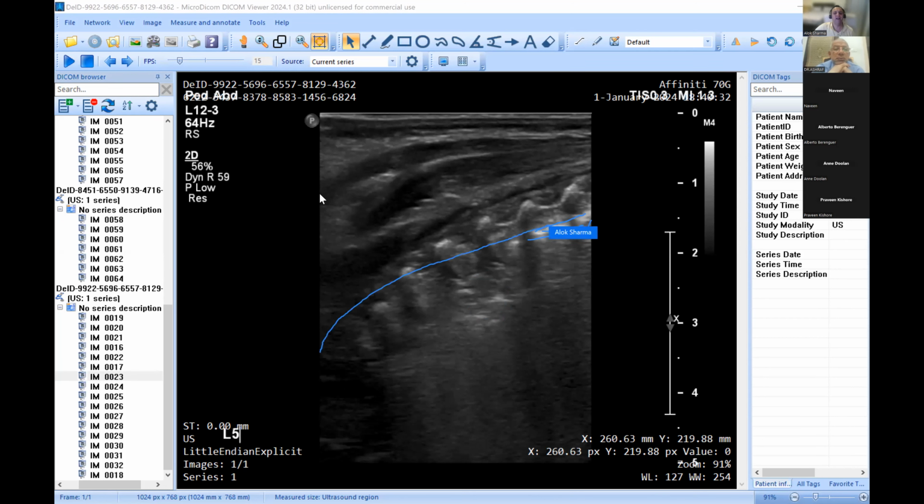I just wondered, were you catching more of the ribs, or just not being perpendicular to the lung? Either you're catching more rib, or it happened to me once that I was catching spine rather than lung. Definite possibility. Naveen, were you quite close to the spine? Possibly. I moved all the way from medial to lateral, even at L5, all angles actually, so I might be closer to the spine. I would probably guess it was lung rather than spine. My gut feeling is you're probably right.